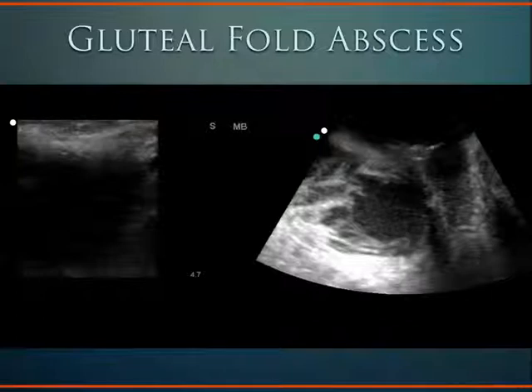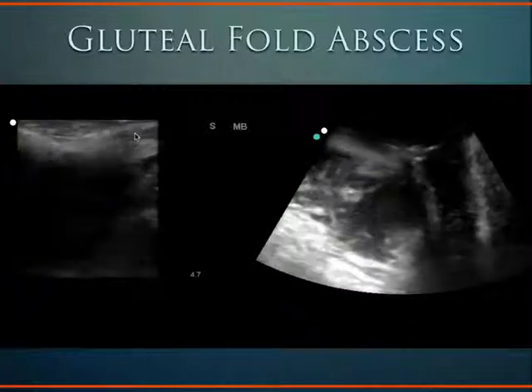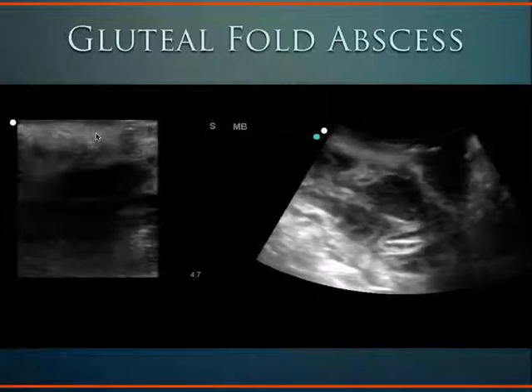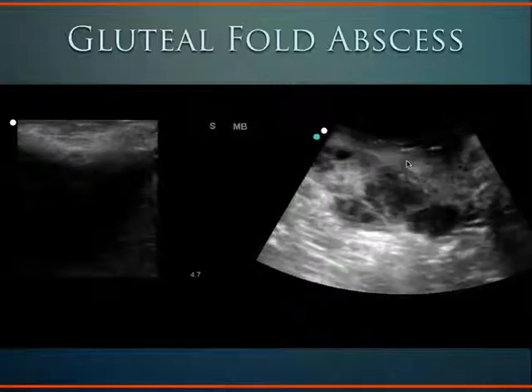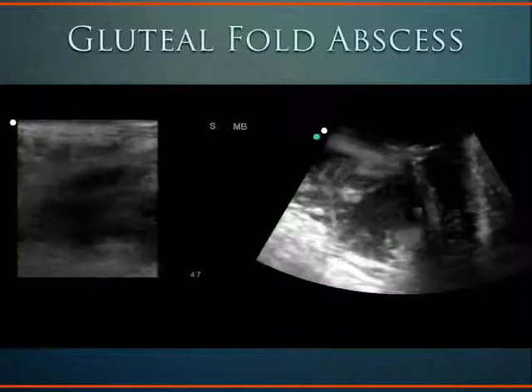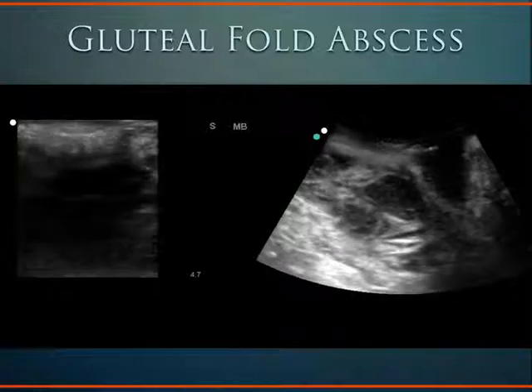Interestingly, on the skin line, there was no evidence of any cobblestoning or cellulitis at all, just normal soft tissue here. No evidence of cobblestoning. His skin wasn't even red. He just complained of severe low back pain. In fact, the resident taking care of the patient ordered some x-rays which were negative. They didn't see any evidence of abscess on the x-rays, which you wouldn't expect to. The bones looked okay, but it wasn't until we did this ultrasound that we saw he had this severe abscess there.